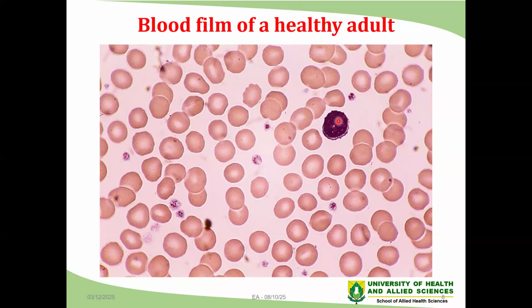And so if you look at the sizes and they are smaller than the nucleus of the small lymphocyte, then you see that those cells are microcytic, meaning that the sizes are below the normal that is expected. And in the event where you meet red cells whose sizes are much bigger or larger than the nucleus of the lymphocytes, we will say that those cells are macrocytic.